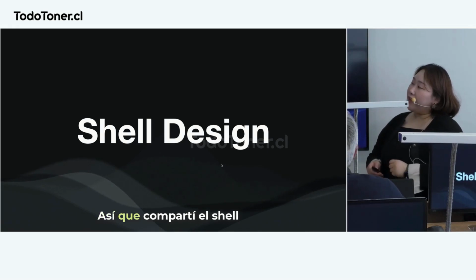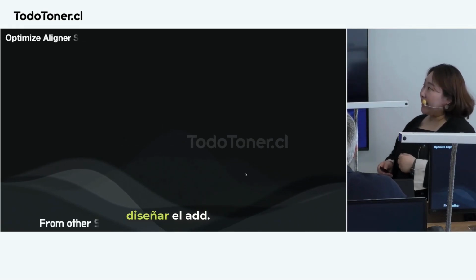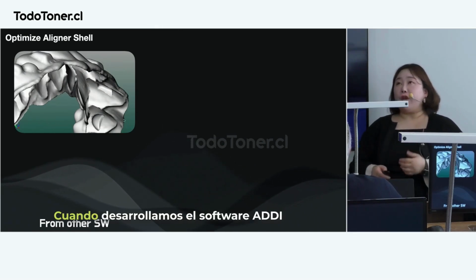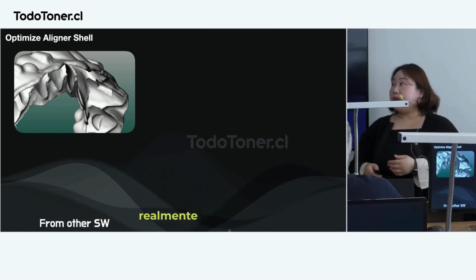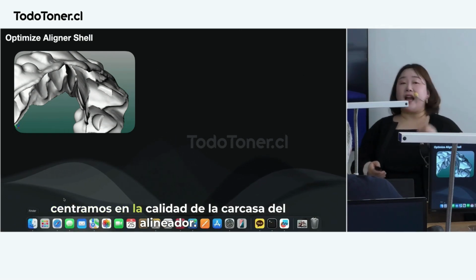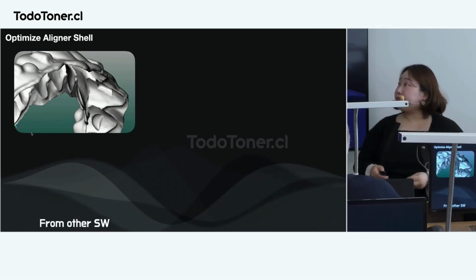So I share the shell design. When we developed the AD software, we really focused on aligner shell quality.